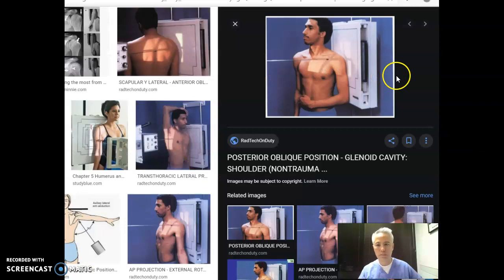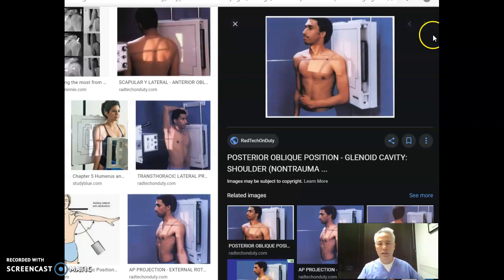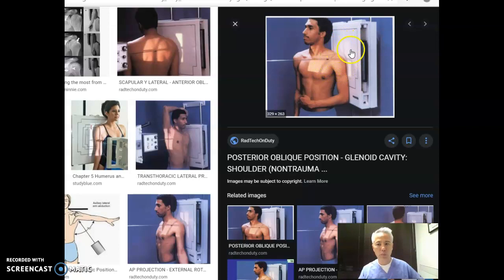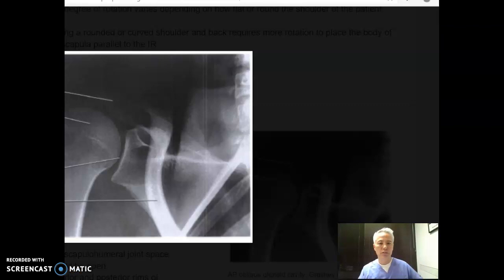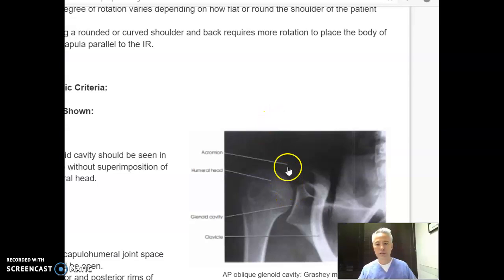This is also our Grashey view. You can see that the patient is pretty much at a 45-degree angle, their hand just across their body on their stomach. Field size should be a little bit smaller than shown. Obviously the more light field you have at the top, the worse image you're going to get. You can see that the coracoid is pretty much burned out — if it's burned out, we're not going to see much. If your light field is open all the way, you're just generating too much scatter radiation, which is dirtying up your image.